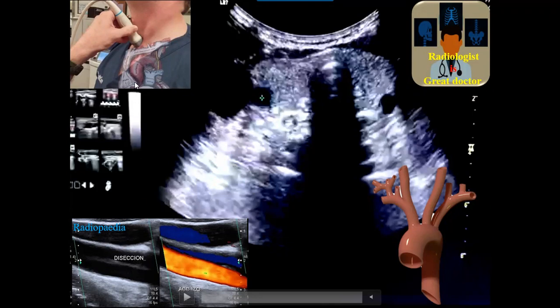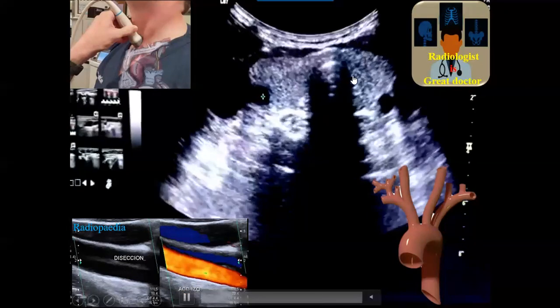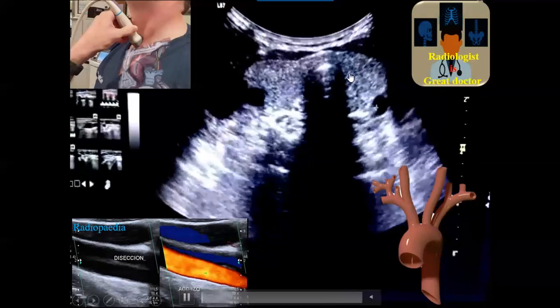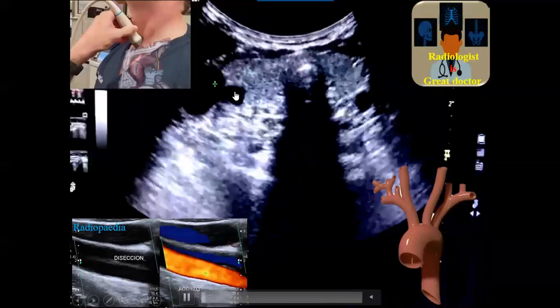We can visualize the superior mediastinum arteries by a very simple approach: just put your transducer in the suprasternal notch, or a little to the left or to the right. What you will see here are both lobes of the thyroid gland.